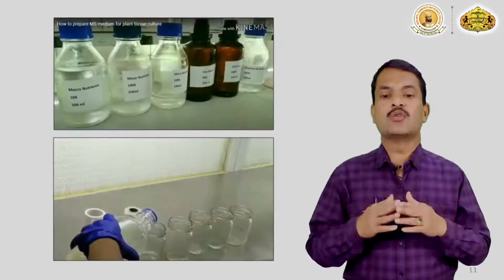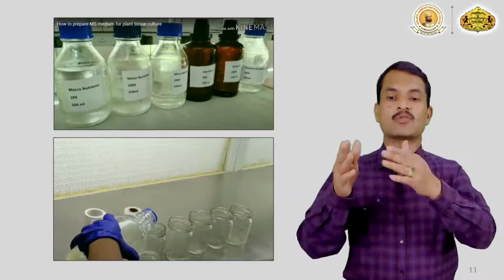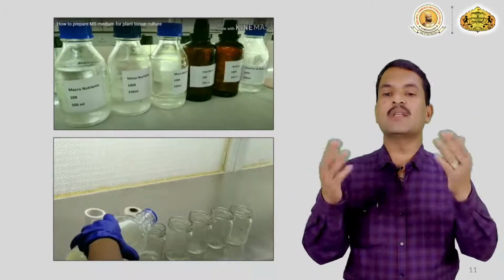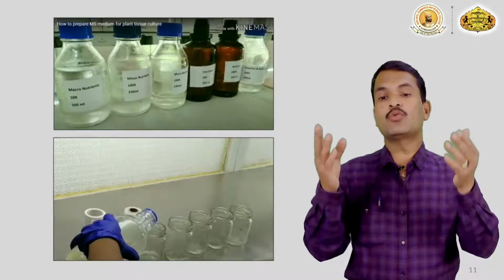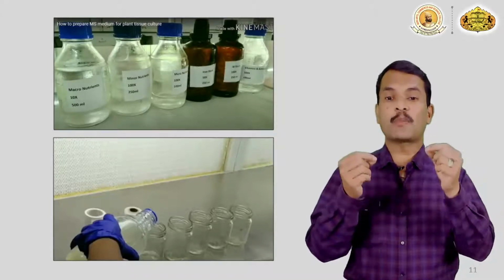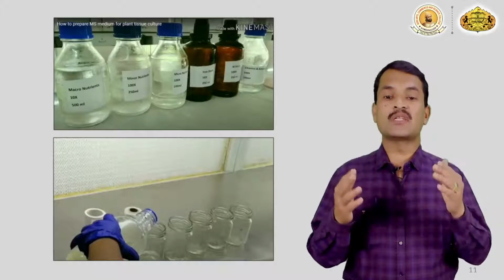Here, you will be able to see how we prepare media. There are different bottles in which we have already prepared stock solutions of our media. You need to take them, mix them in an appropriate proportion, and then make the final volume with distilled water.